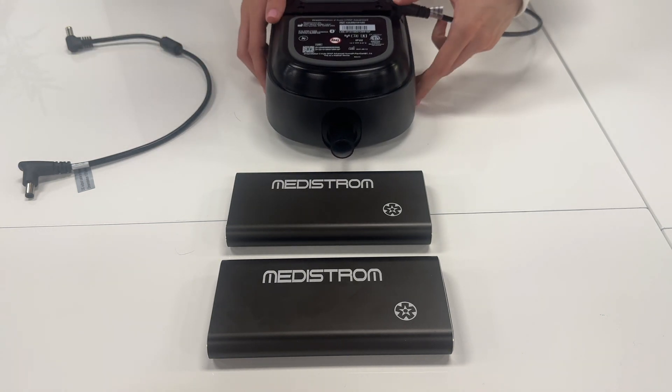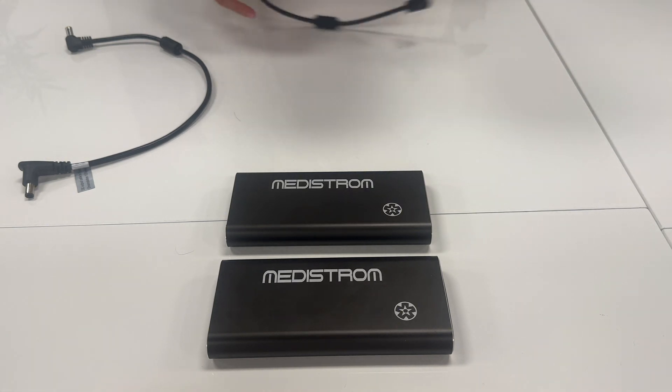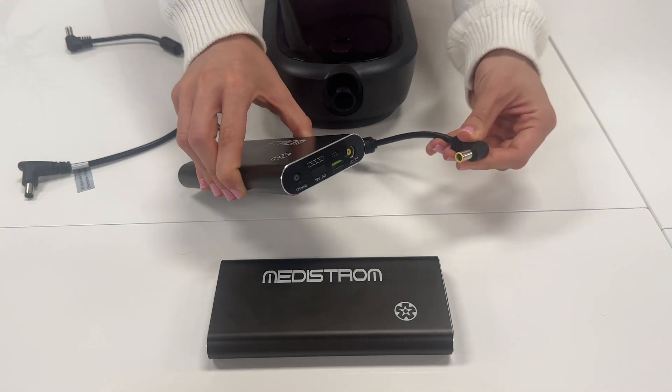Begin by taking the cable that is compatible with your CPAP machine and connect the appropriate end of the cable to the PAP device. Take the other yellow L-shaped end of the cable and connect it to the yellow DC output on the primary PilotFlex battery.